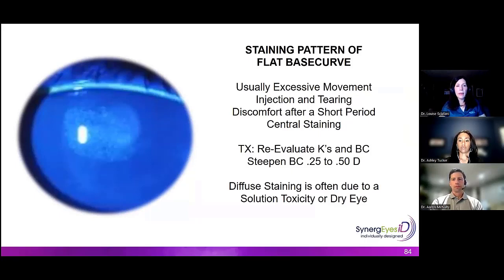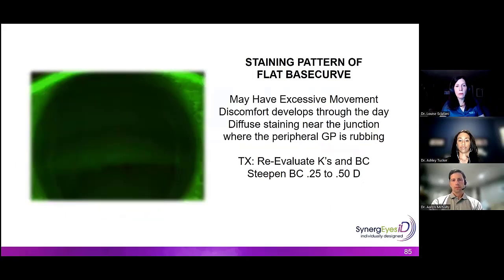This is the typical staining pattern if the base curve is too flat, but these patients will have a different symptom. They'll have excessive movement, some discomfort pretty quickly after wearing it, and the central staining. Again, reevaluate the Ks and the base curve, and you're going to have to steepen this. Could also be due to toxicity from solutions. I love what Aaron said about putting a little bit of saline or a multi-purpose solution in the bowl. It will squeeze out eventually, but it's a nice way of introducing the lens.